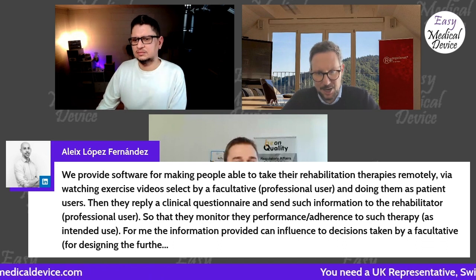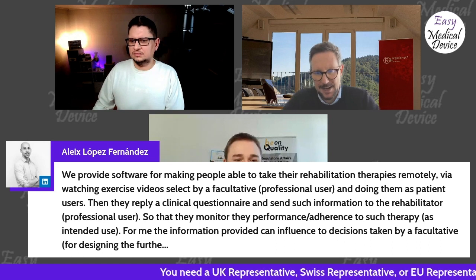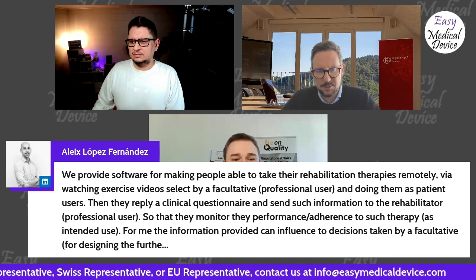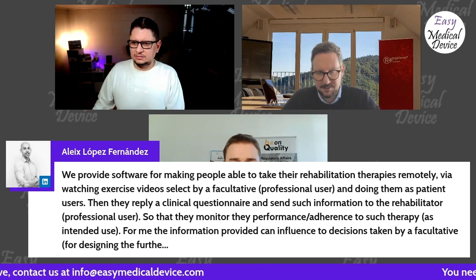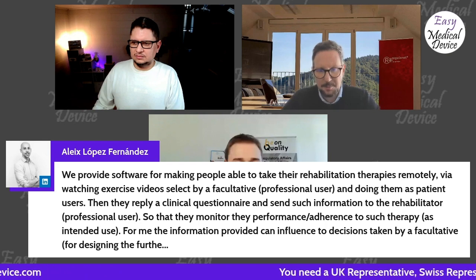prose text we are seeing now, break this down into a table, into different sentences, and then look at each one, because we are talking about, for each of the sentences, a kind of functionality. So then break this down into your functionalities, and then evaluate it. So if you look at the first one, as Stefan said, if you just provide videos, it's like YouTube. This is not a medical device.